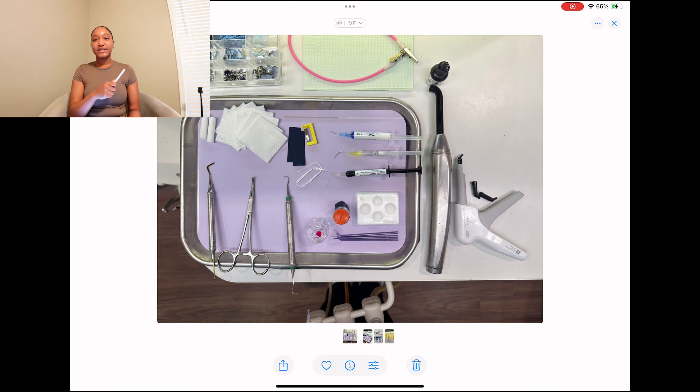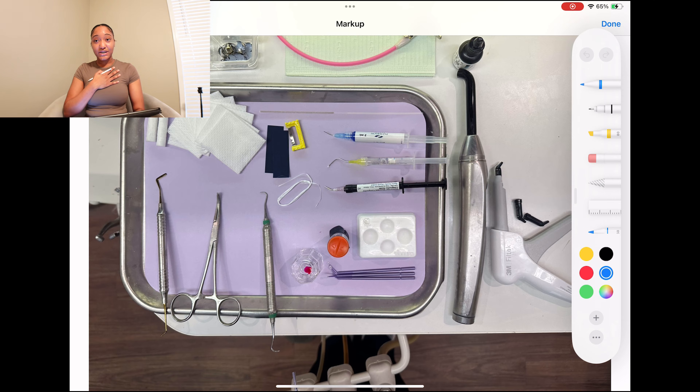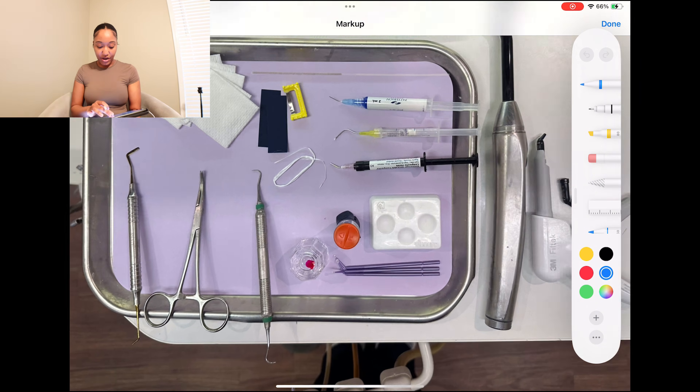Now that I've talked about all the products, we're going to go over the steps and the order you'll be using these products in — whether you're new to the office or have a test coming up. Procedure order usually starts with the dentist going in with her high speed to carve out the shape and then taking her slow speed to round out the rest of the soft dentin. This is where you're also going to use your caries indicator.